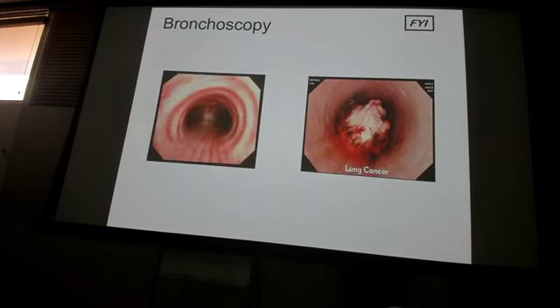All right, so this is looking down. Right here, is this the right or left? Right, so yeah, if you can see into it, most likely the right, more vertical, wider. And then this is lung cancer. Do you think this patient is asymptomatic or symptomatic? Symptomatic. Yeah, so this is very advanced lung cancer. This is somebody without insurance, homeless, who finally collapses and they call an ambulance and bring him to the ER, this type of thing, or somebody who is on hospice, terminal, and they're in the final stage, this may be what it looks like.